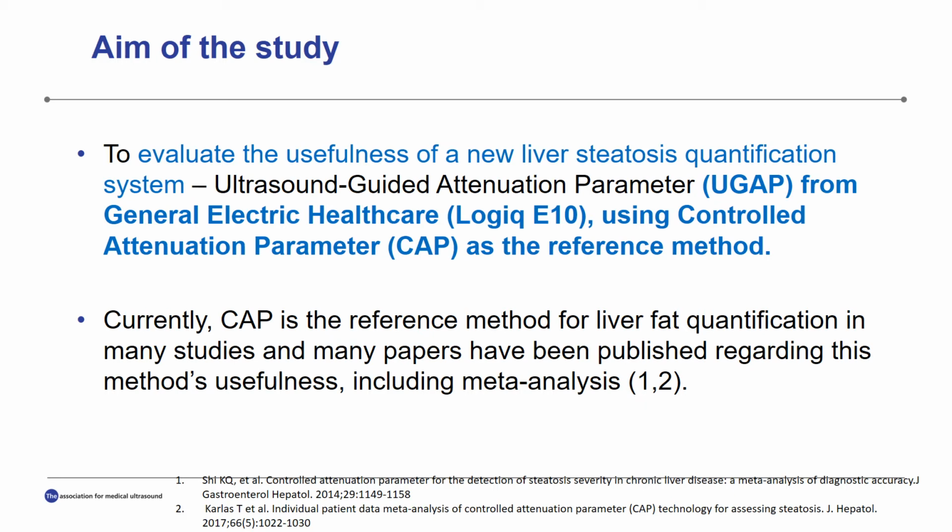There are some meta-analyses looking at the accuracy of CAP for fatty liver quantification, and there are 2 important ones. One is published by Xi and the other by Ka.